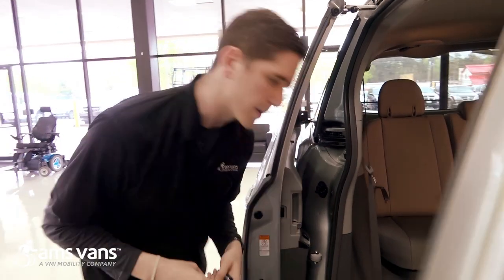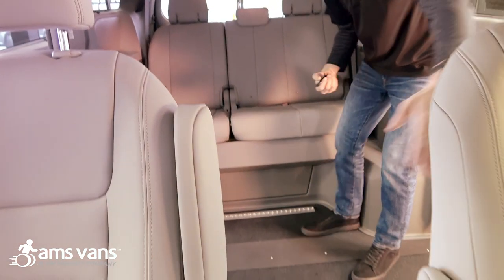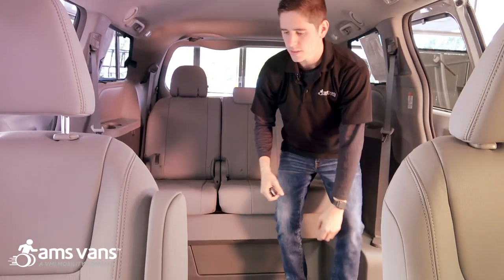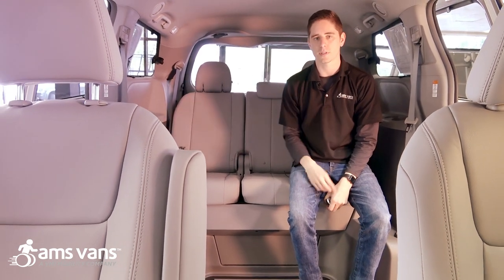Now we're going to go inside and look at some of the interior on this conversion. From behind the front two seats to back here you've got 65 and a half inches, and you've got 61 and a half inches going across in the center floor width. It's really designed so any power wheelchair can come in here and do a full 360 turn.